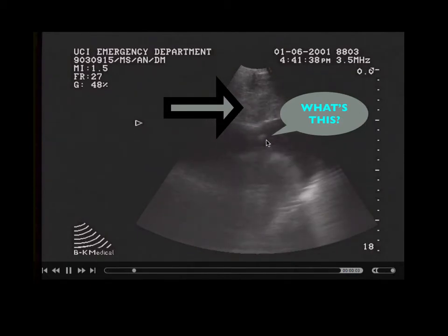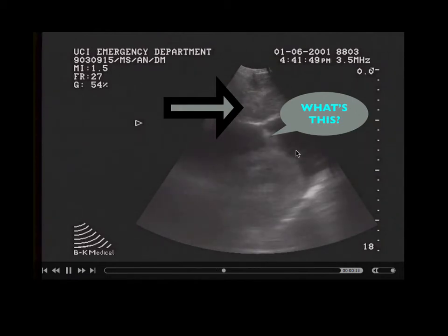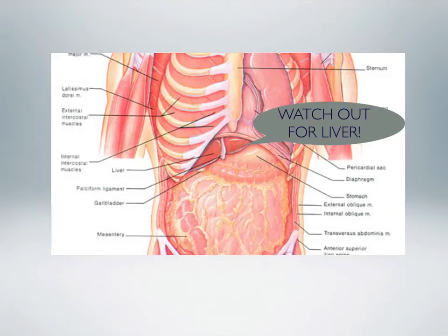You'll see later on there's a shadow that comes in here, and that's actually a guide wire that's coming in, and a catheter will follow. Tamponade is readily visible, and we'll explain shortly why there's the catheter, by the way. We'll explain now why it is not typically too crucial that the liver has a needle going through it.